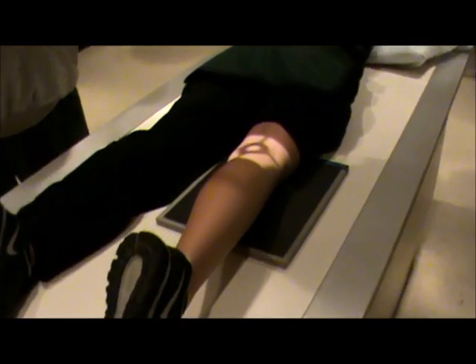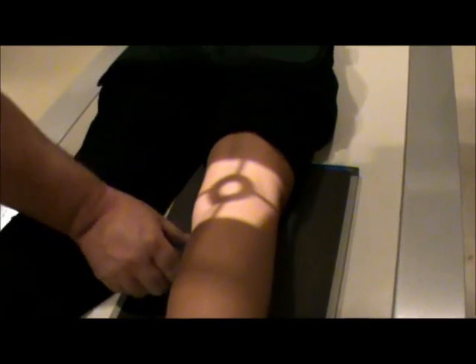This will be our PA view of the patella. Next, we're going to do our lateral.